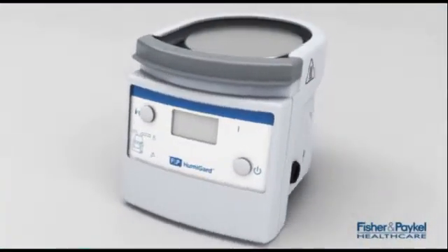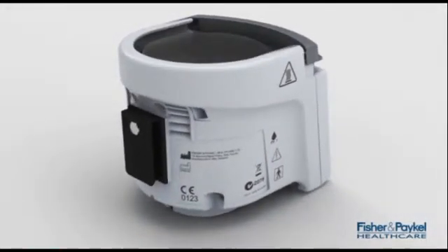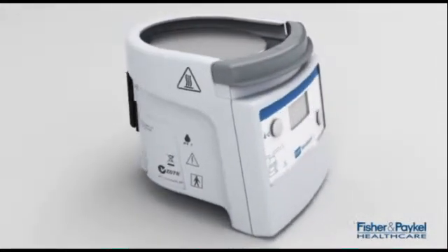Ensure the MR860 surgical humidifier is mounted correctly and the power cable plugged in. Remove the sterile heated tube from the Humiguard clamshell packaging and place in the appropriate area.